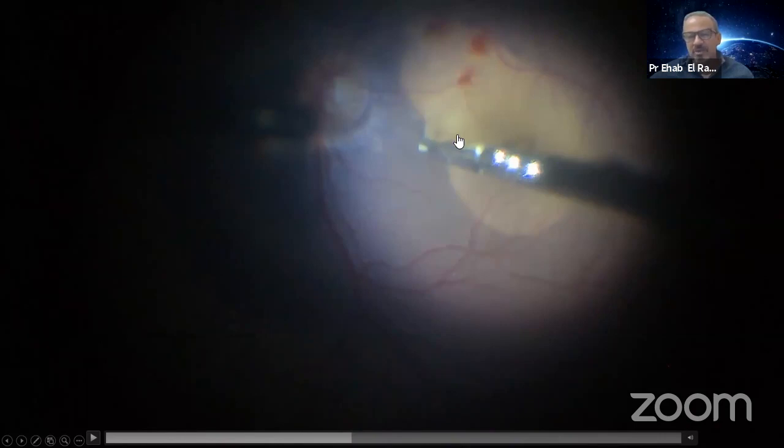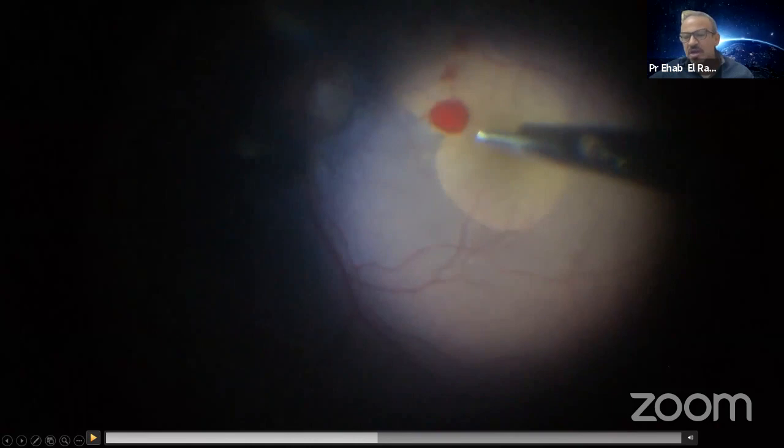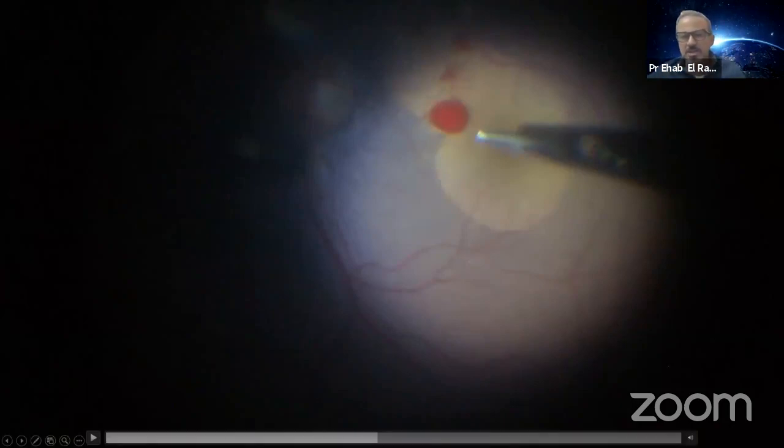It's a whip-like effect. When you pull the ILM and release it, all of a sudden, the inner retinal capillaries can blow out. So let's see this hemorrhage happen here. You ready? I remove the ILM. Look what happens when I release the ILM. There. It starts to bleed. So this is not a direct injury, but a recoil or whiplash effect due to recompression that happens to the inner retinal capillaries. Let's ask the panel, how would you manage something like this in a case of a macular hole? The question goes to Carl maybe first. What would you do, Carl?